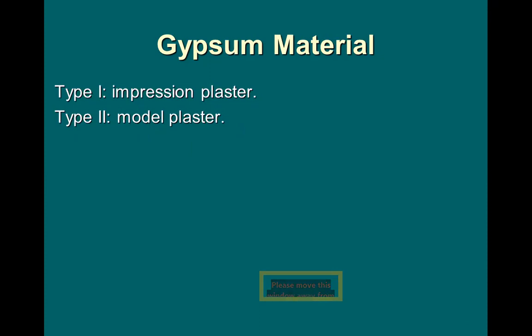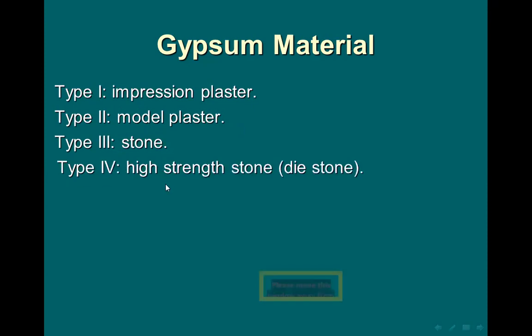وعندنا الستون اللي دائما نستخدمه بصورة واسعة الاستخدام. وعندنا الدايستون هنا ممكن نستخدمه. الدايستون بالكراون بريدج يستخدم بصورة عامة أو بصورة دائمة، لأنه مادة تعتبر أقوى من الستون الطبيعي أو الريجولار ستون.